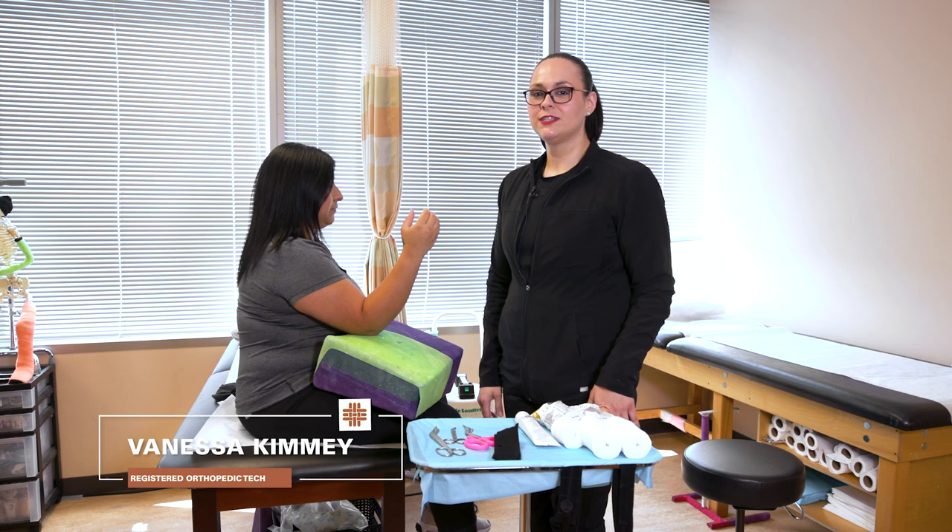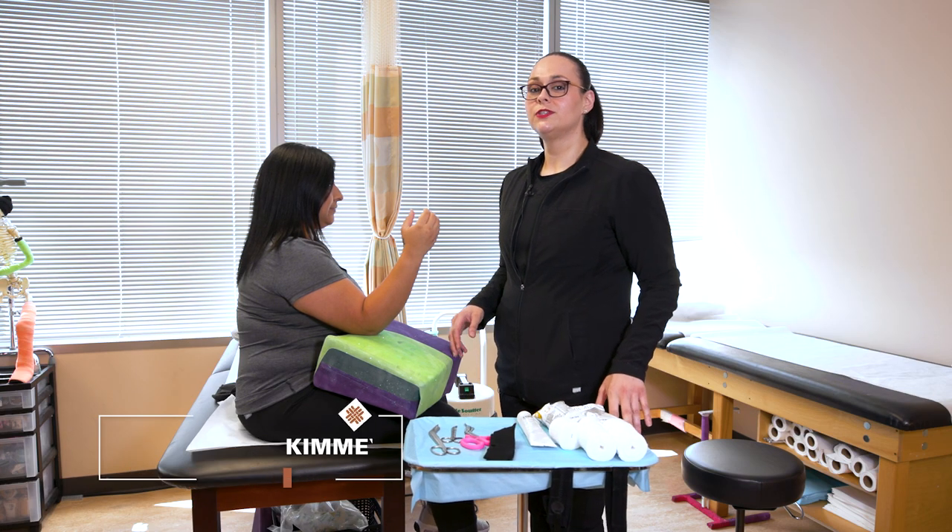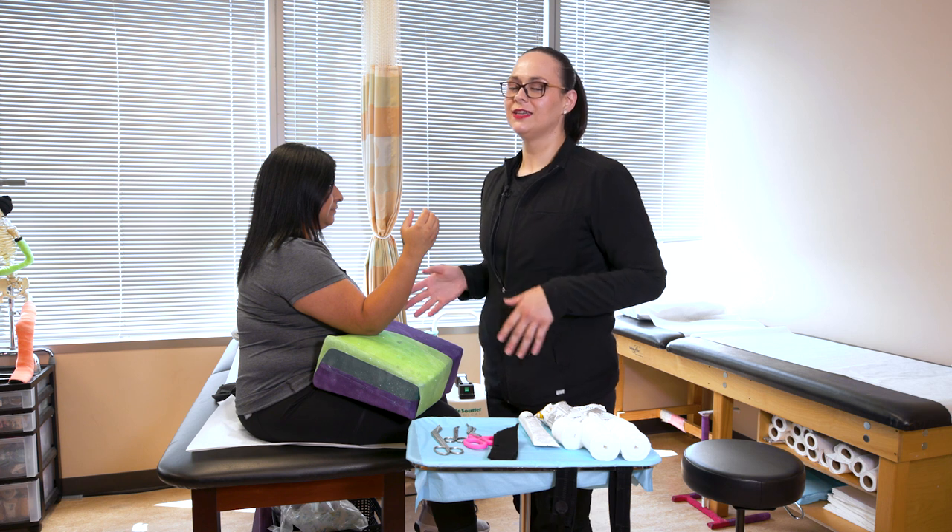Hi, my name is Vanessa with UT Physicians and I'm going to demonstrate what to expect when getting an arm cast and a few extra tips.